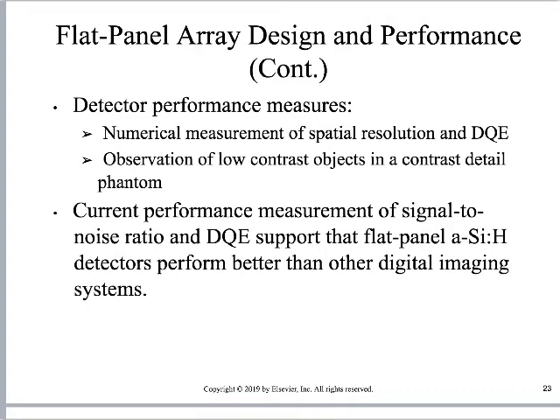There's two things that can result from this, two things that we should understand. First, spatial resolution and detective quantum efficiency. I guess that's really two things, but numerical measurements of spatial resolution and detective quantum efficiency are going to be influenced by this. And the other thing is going to be low contrast stuff. So she's saying there's a direct connection between modulation transfer function and detective quantum efficiency. And then the separate thing would be low contrast stuff. For the most part, the TFT flat panel systems, the direct capture systems, are going to have the higher DQE.